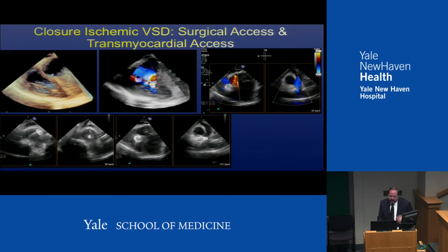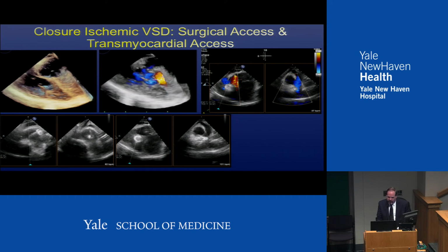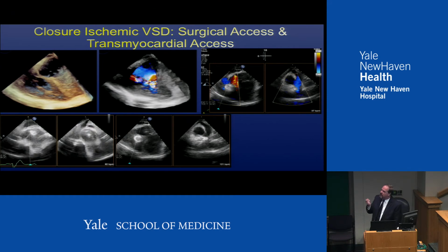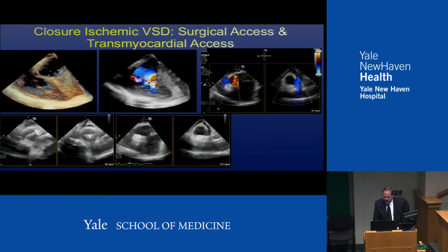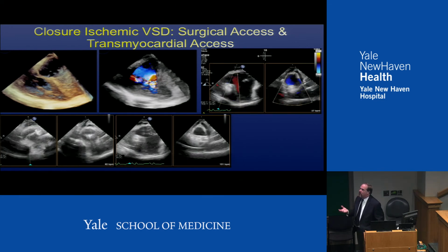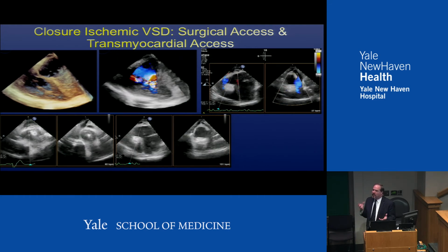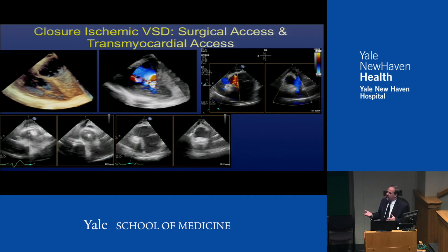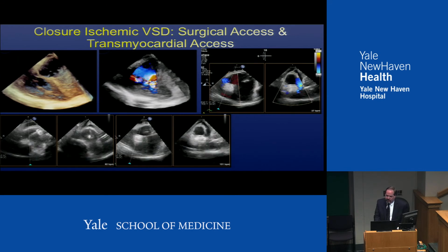And so this shows the 3D TEE on the left. There's the color flow. You can see down here, this is the device going through. See how we're pulling the device into the defect. In this case, a VSD occluder device on the lower left. And then we can show the device in place. So this is the residual up here. There's still some residual VSD, but it's not much. But we can change the approach based on understanding of the anatomy using structural heart disease, 3D anatomy, but then guide the procedure. This was not done with EchoNav, but could be done with other procedures.